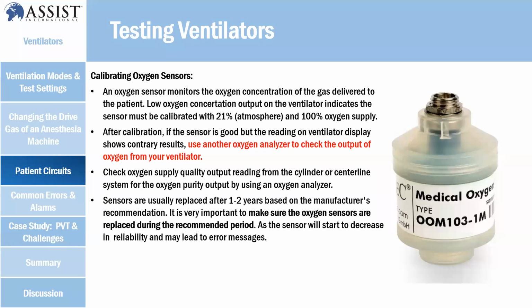If the calibration fails or you change the sensor and your calibration reading is not good, compare with another oxygen analyzer, because sometimes, if you are using a centralized system and you don't monitor your centralized supply, maybe you end up getting a low oxygen incoming. So it's better to have another oxygen analyzer to verify this.